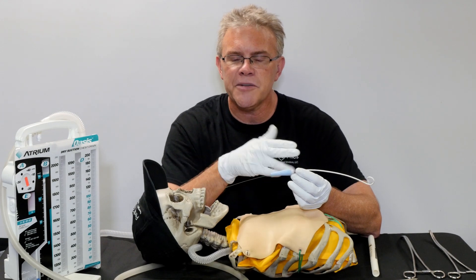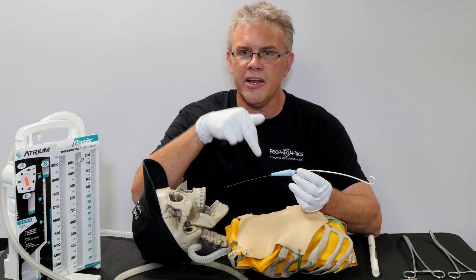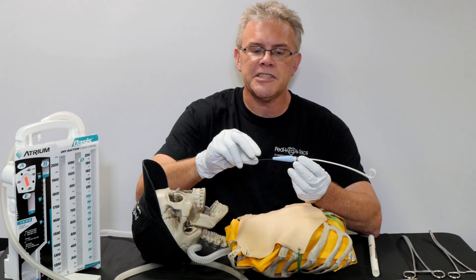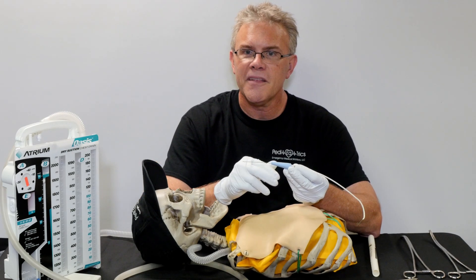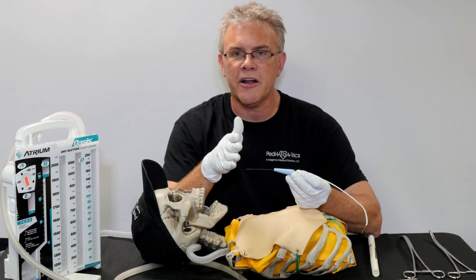Placing a pigtail is just like popping in a central line. Remember, when your docs pop in a central line, they stick in the needle and they're sucking back in the syringe — because when they get blood, they know they've hit what they're trying to hit. Once they're in the right spot, they just advance the guide wire, and over the top they thread the IV catheter.